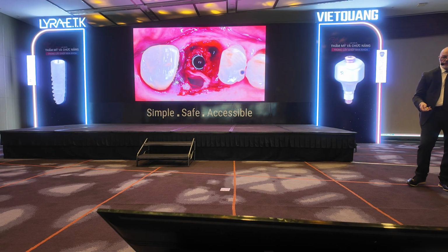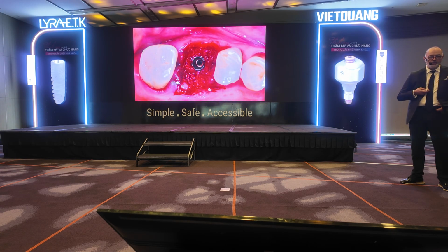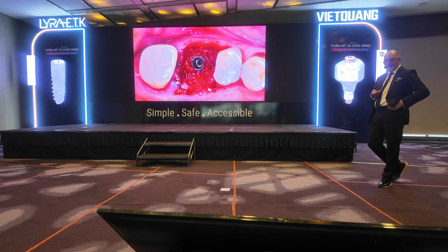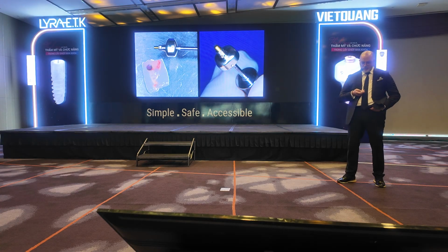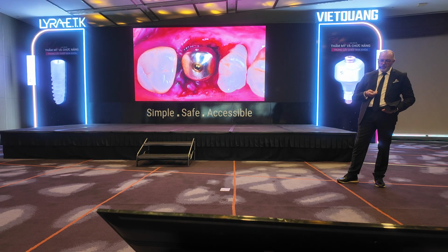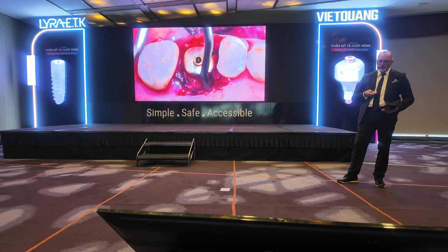In the palatal root, what I did is that I put the PRF in the alveolar before filling it with artificial bone, in order to isolate if there is any infection still in the palatal wall, bone or whatever, just to isolate it from the artificial bone. And then always using the PRF before to suture on this.